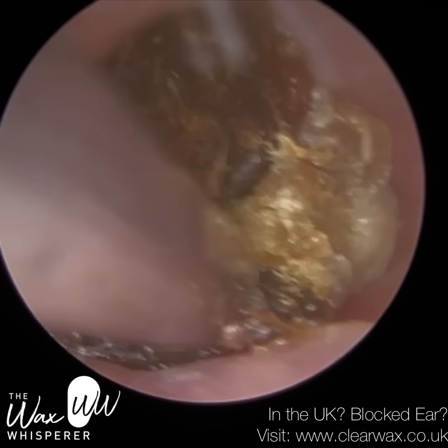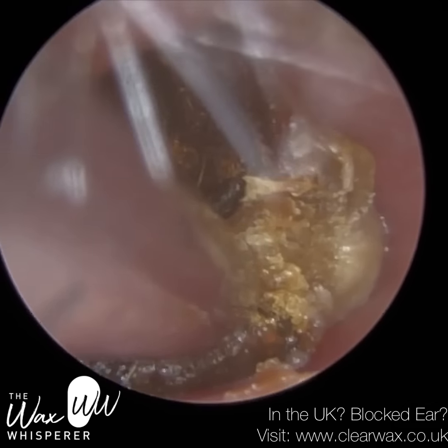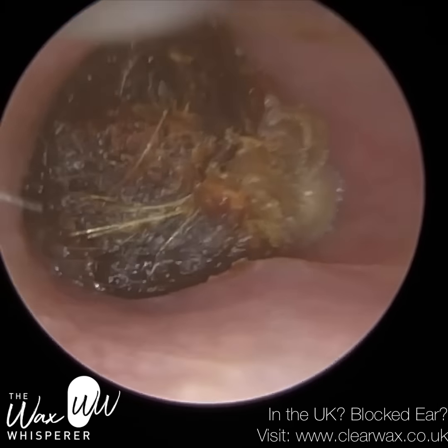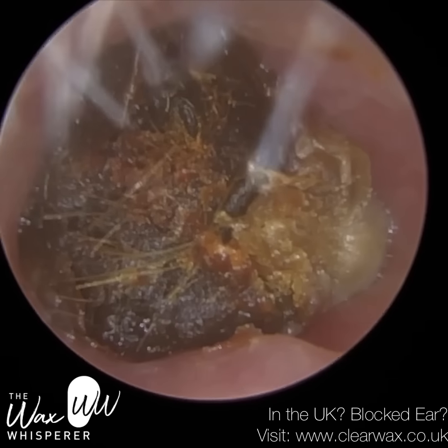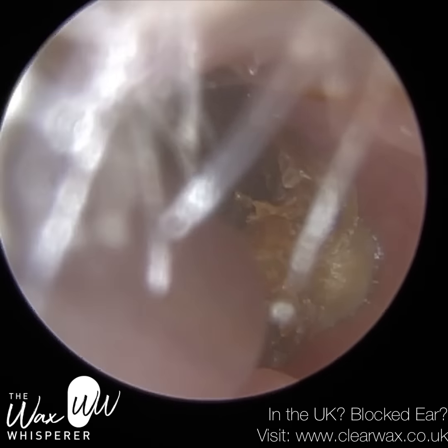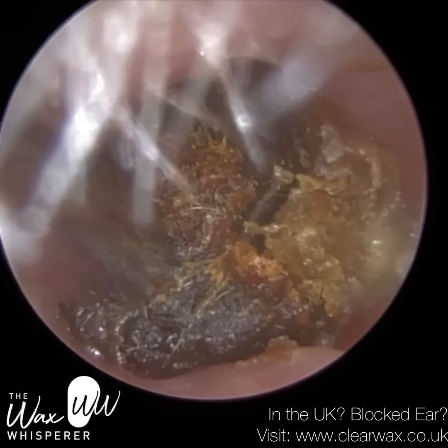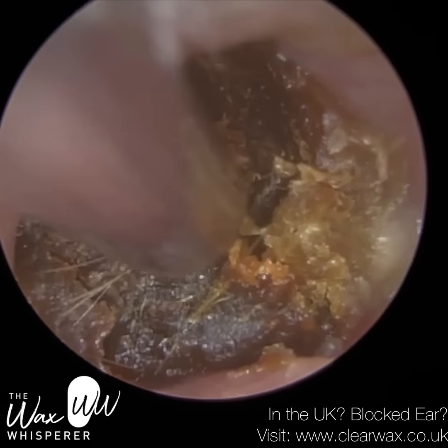And as you start removing the skin plug, you rupture the blood vessels inadvertently. It's unavoidable, really. That's because as the skin plug's coming off the canal wall, or the connective tissue breaks down, that makes the granulation tissue, and the blood vessels rupture. So a hallmark of grade 3 is bleeding. We call it contact bleeding. So you lift the plug away from the canal wall and there's blood there.